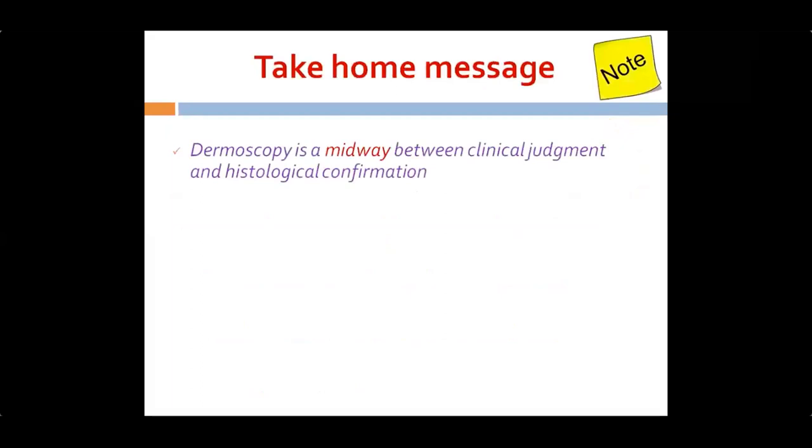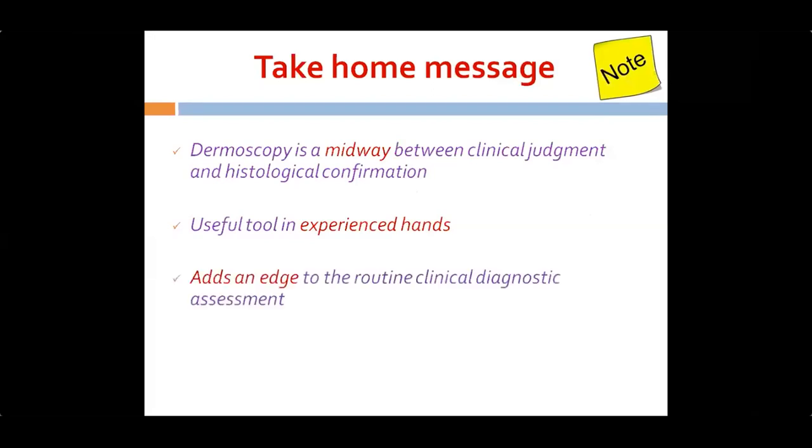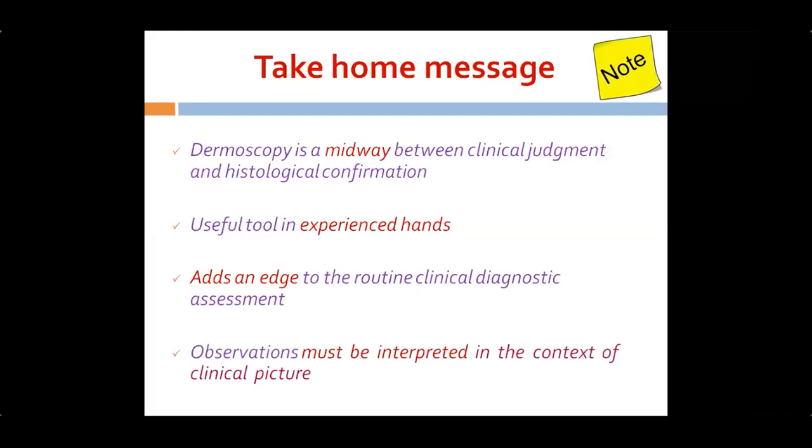To conclude, dermoscopy can be considered a midway between clinical judgment and histological confirmation. It's a very useful tool in experienced hands, so it needs a lot of practice, training your eyes and brain repeatedly. It definitely adds an edge to the routine clinical diagnostic assessment. As discussed earlier, it either confirms your clinical diagnosis or gives you an alternate diagnosis as well. And most importantly, all dermoscopic observations must be interpreted in the context of the clinical picture.